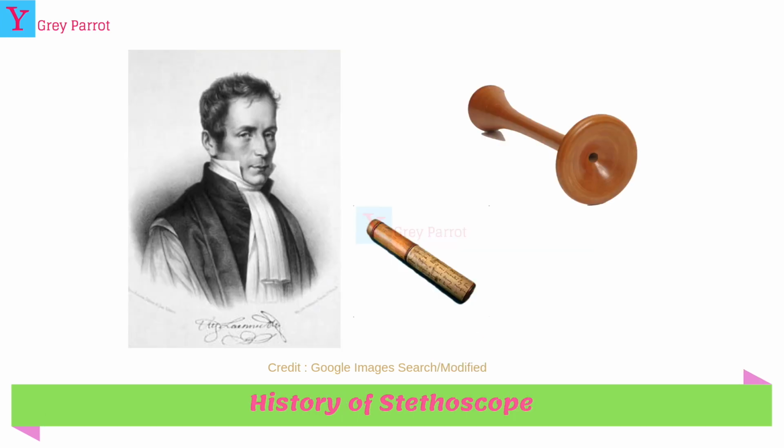Now let me tell you a little bit history of stethoscope. It was invented by French doctor René Laennec in 1816, who you can see in the slide. In those days, he was using his ear to listen to human heartbeats. One day, a young lady visited his clinic. She felt so uncomfortable when Laennec kept his ear on her chest to listen to heart sounds. From that day onwards, he was thinking of alternatives.